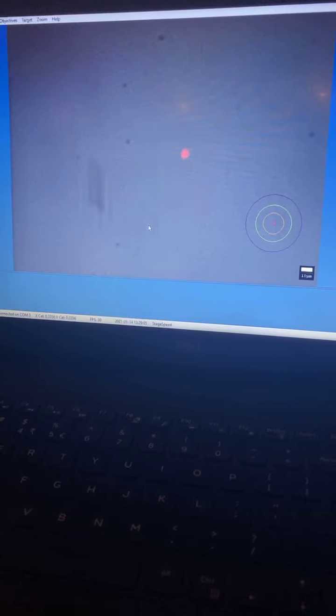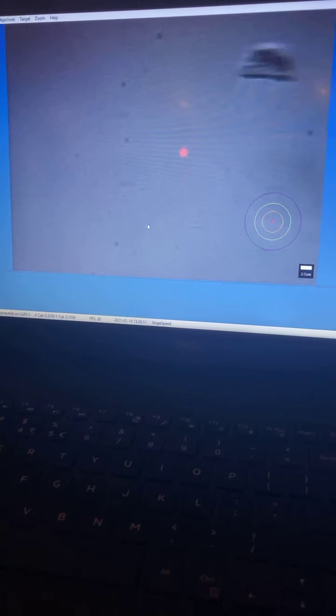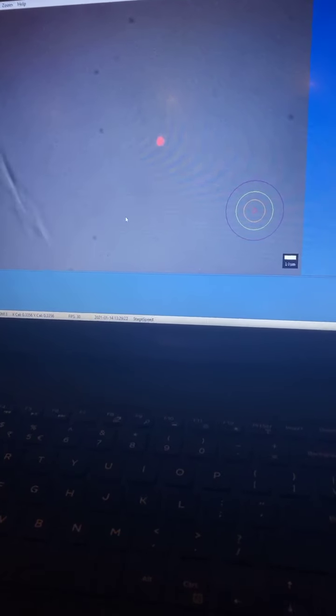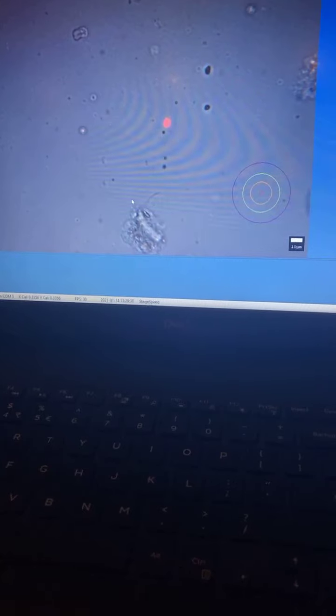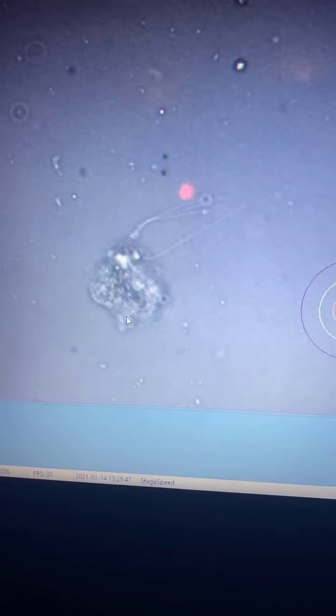I'm close to 60 to 70 fields and still expanding. We are close to 80 fields now and very soon approaching 100 fields. Once we reach 100 fields we have confirmed sperm retrieval. See here — there are two to three sperms in a cluster. This is sperm number one and you can see there are other sperms placed in a cluster. These are good, live sperms and I'm going to allow this to be cultured to get motile sperms.